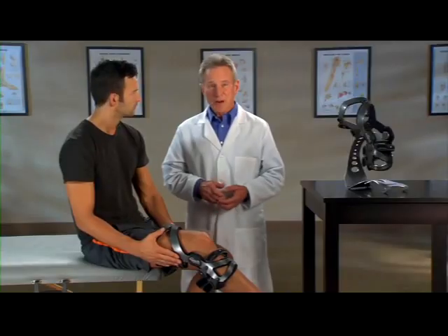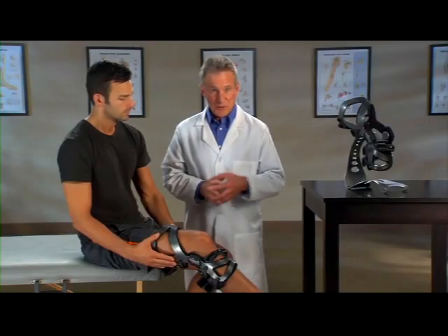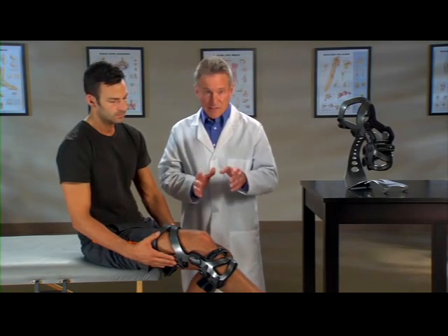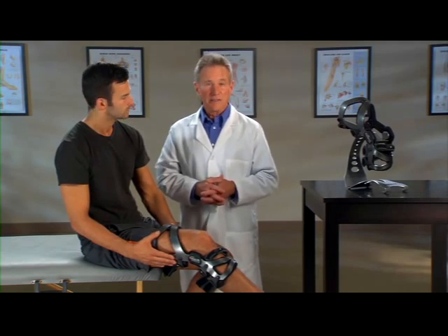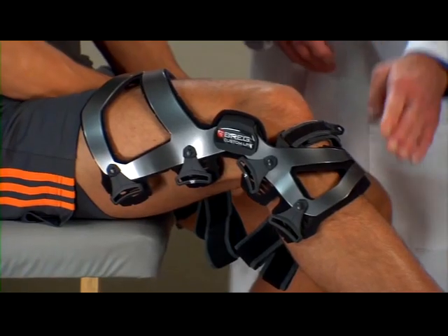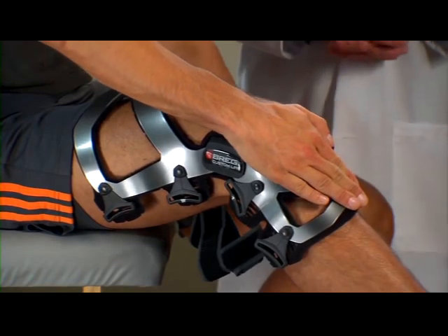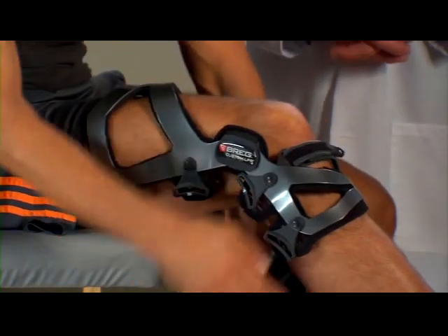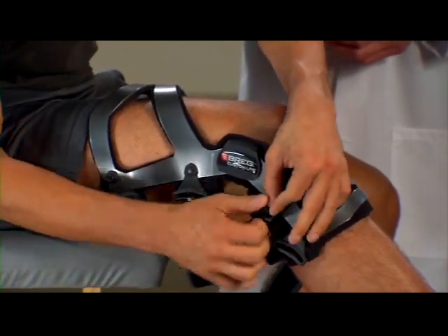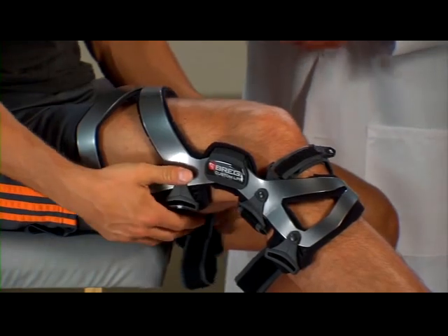Now we'll go through the strapping sequence. As you can see, the straps are numbered, making it easy to follow the correct order. As you go through the strapping process, make sure each strap is tightened snugly but comfortably, with equal tension so that no one strap is tighter than another. With the brace on your leg, press the shin cuff on the front of the brace flat against your leg and fasten strap one behind the calf. If the straps are too long, adjust the straps accordingly. Fasten strap two in the back above your knee.